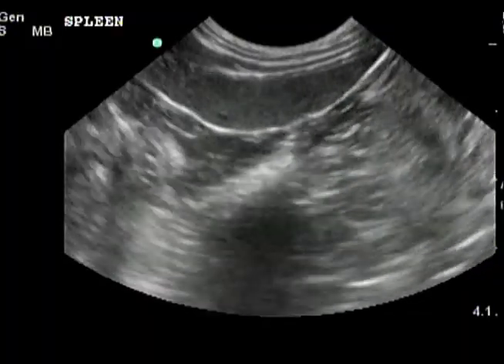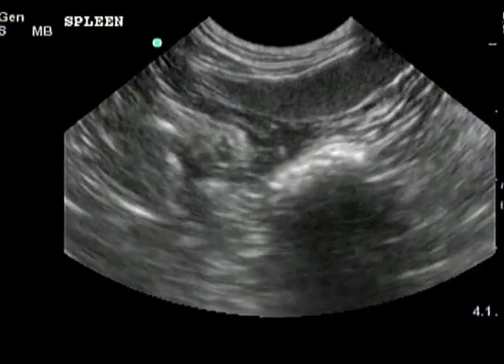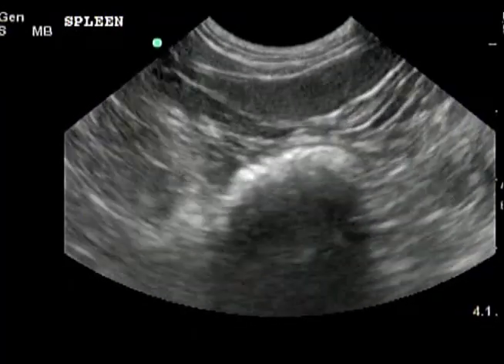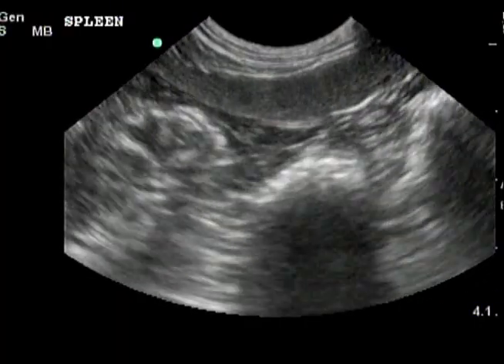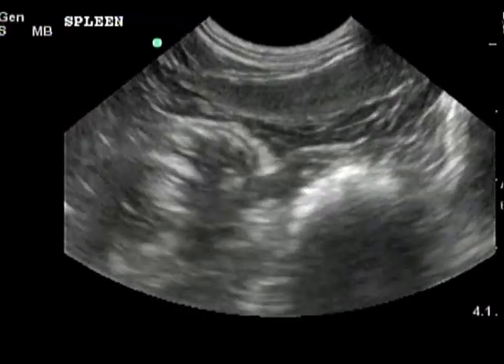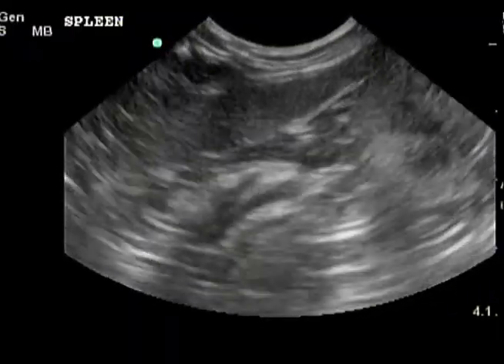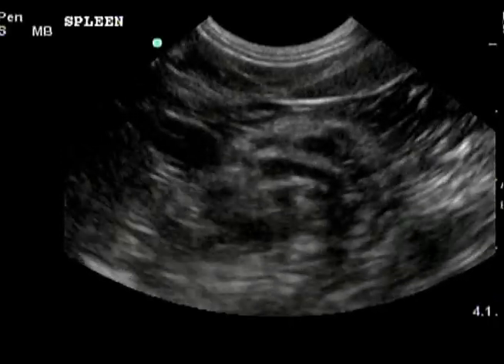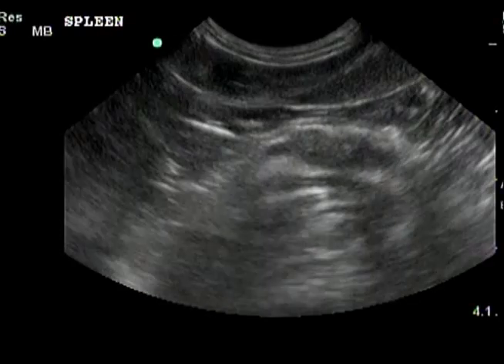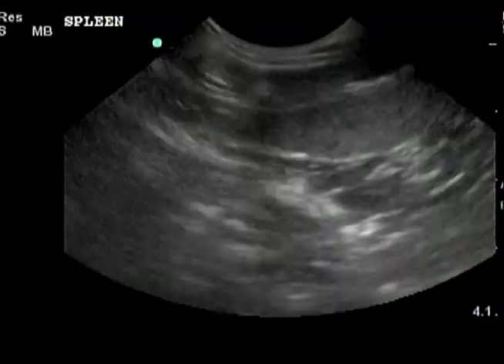In one study, 90% of pancreas lesions confirmed by histopathology appeared normal to the naked eye of the surgeon at the time of the biopsy. Therefore, it is important to look for other ultrasound signs that may suggest pancreatitis. The absence of any ultrasound lesions of the pancreas still does not rule out pancreatitis.